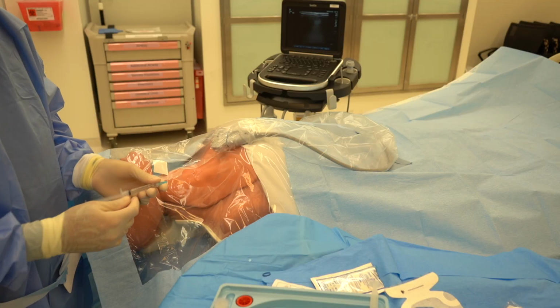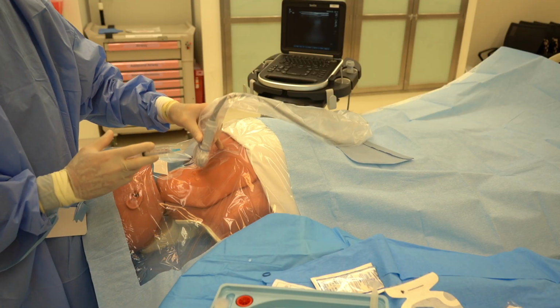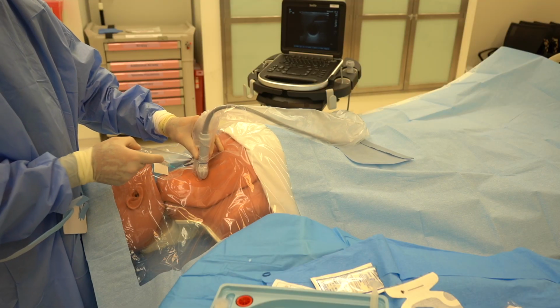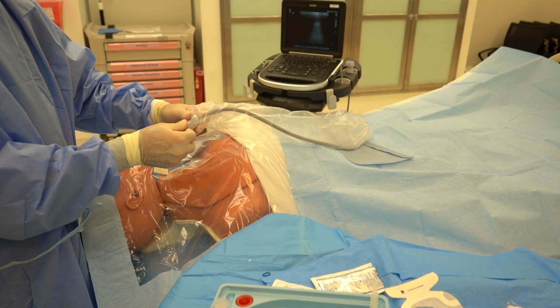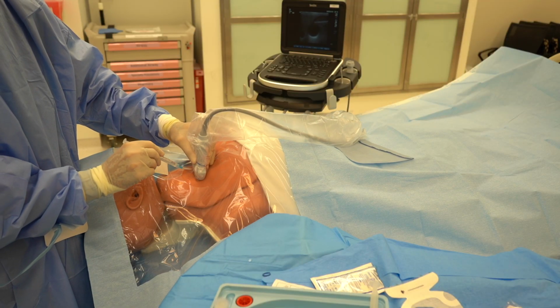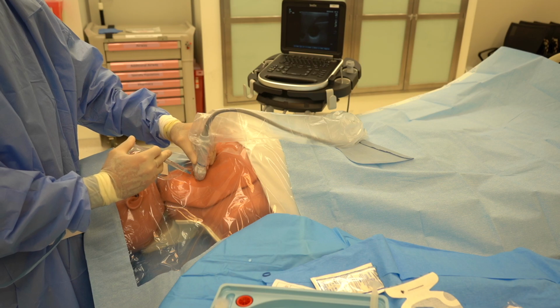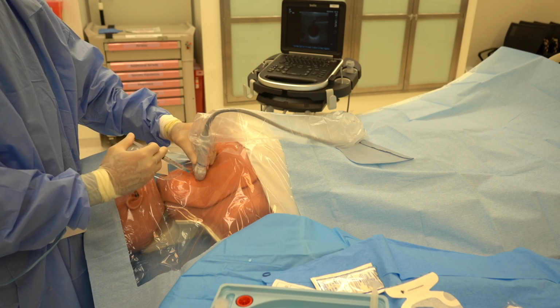Being careful not to inject without drawing back, as the EJ here is very superficial. We'd like not to inject lidocaine systemically. Now we'd also like to numb deep. You can see here on the ultrasound our vessel is less than 1 centimeter deep, so we can stay with our shorter anesthetic needle, but there is a longer needle if needed for deeper vessels, especially in the femoral.